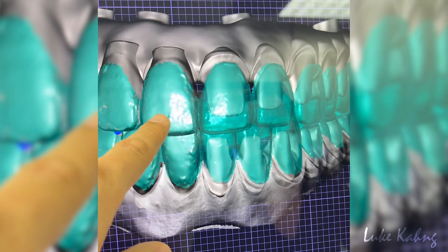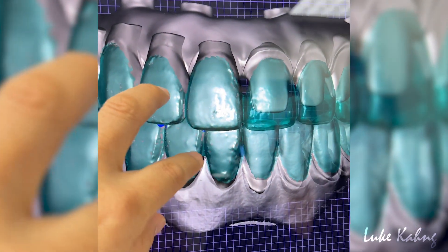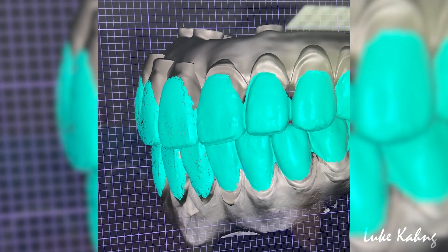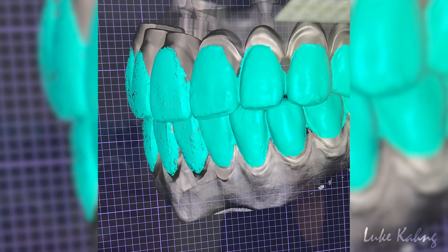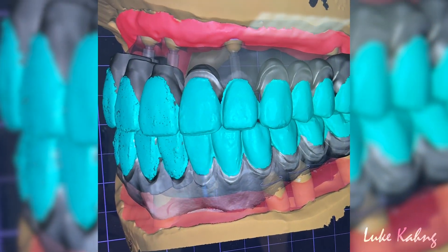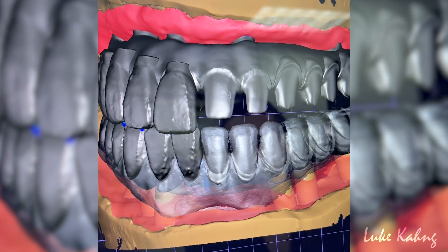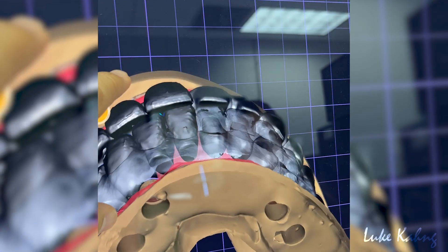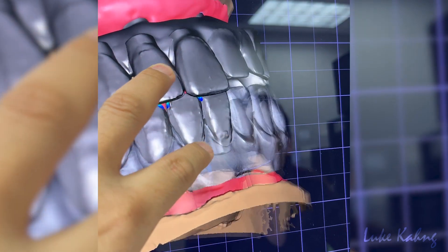Yeah, that was the wax-up so we brought in the final bit, so that one is the final markup. Then cut it back entirely, bring it in. This is another technique — about 5-6mm going down the side. Yeah, that much, that's cool.